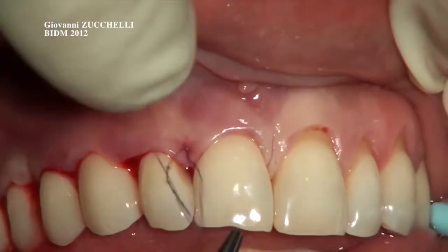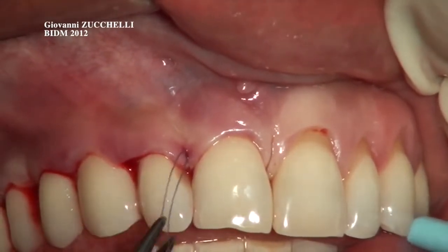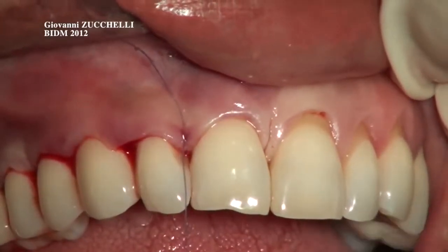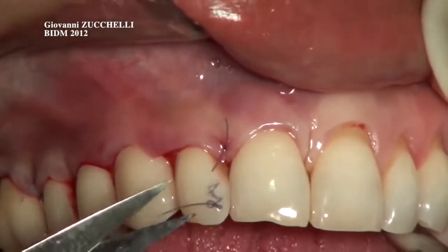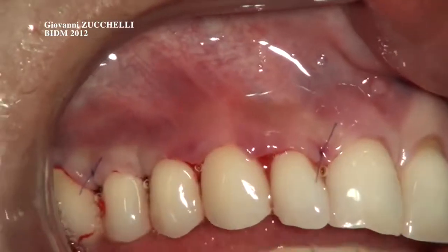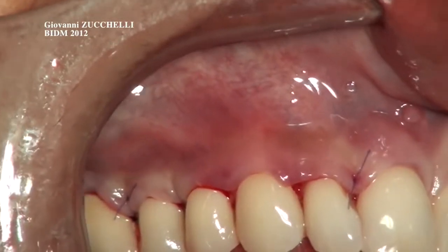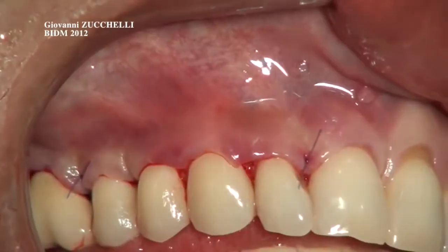Obviously, coverage must be performed in excess in order to guarantee an optimal adaptation between the keratinized tissue and the convexity of the root, of the crown, sorry. Now you can see that with only two sutures, the flap is already stable also at the level of the canine, where we have the greater coronal advancement of the flap and so the greater tension in terms of muscles in this area.